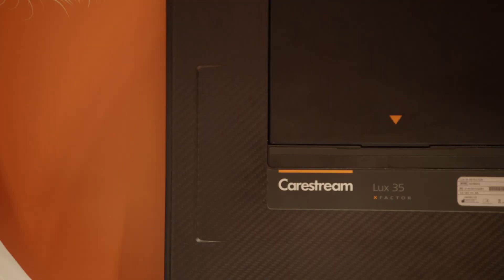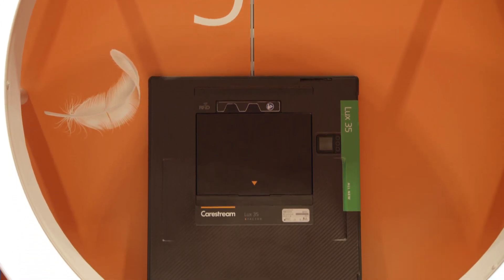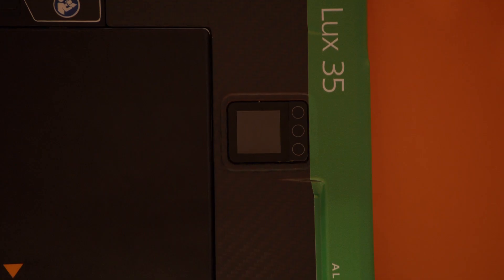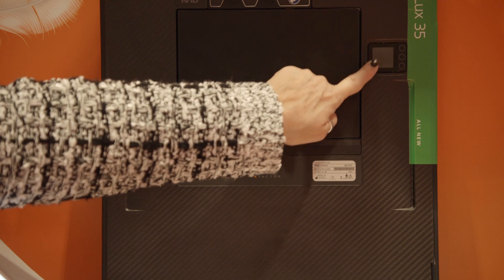It also has integrated finger grips which make it easier to handle and can prevent accidental slips and drops. There is a display GUI on the back to provide important detector status as well as updates. Now I'll turn it over to Jordan — he's going to tell you about our new DRX-LC Long Length Imaging Detector.